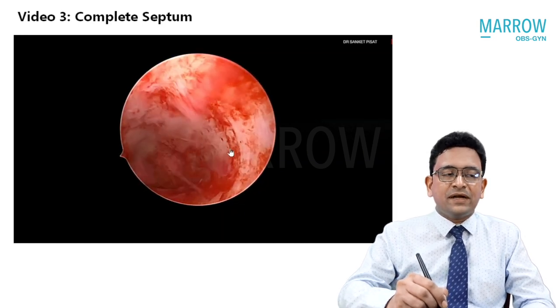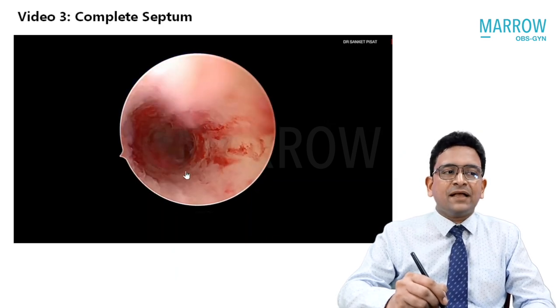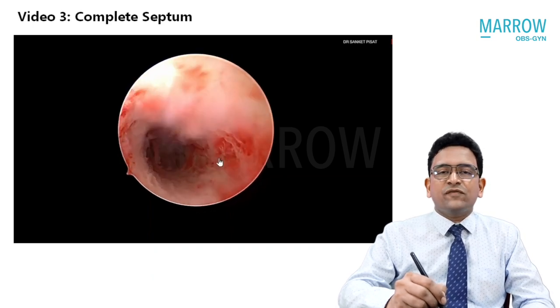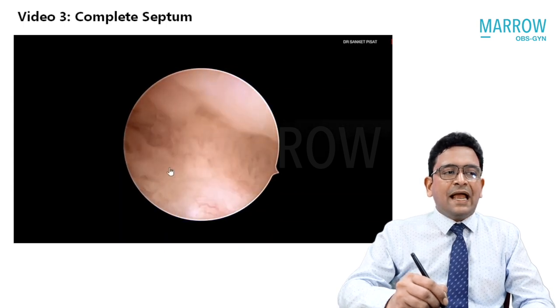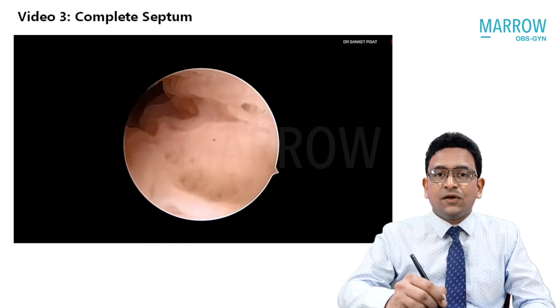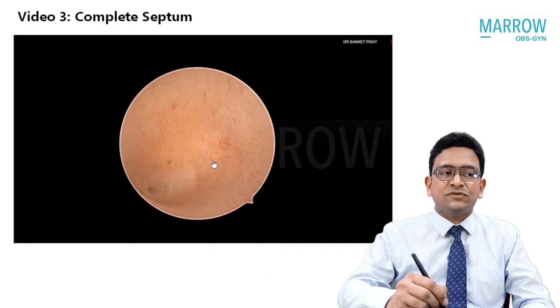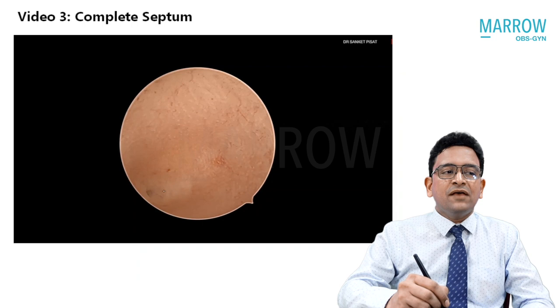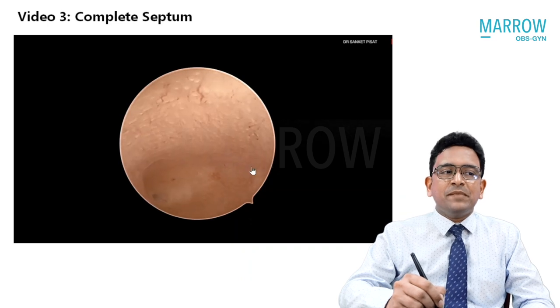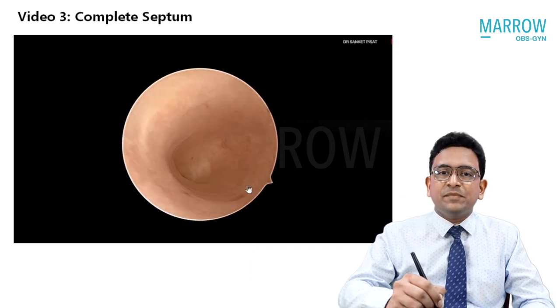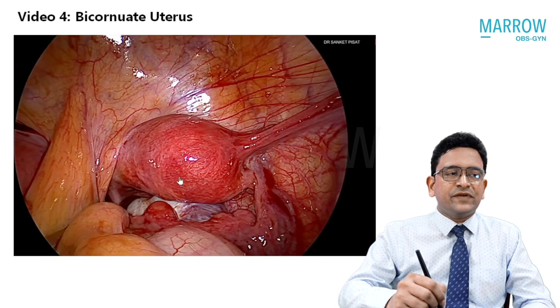The other ostium cannot be located because one half of the cavity has been completely obliterated or blocked by the presence of the septum. The telescope is gradually moved back, and slowly we look for the other half of the uterine cavity. Moving from the right side to the left side, we are able to see another internal os, and this is the remaining half of the cavity. Here you can see the ostium on the other side. This patient also has two ostia; however, the entire midline is blocked by a vertical midline septum, and that is what actually needs to be treated.